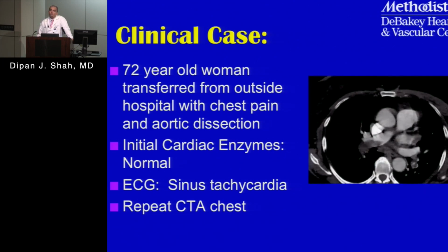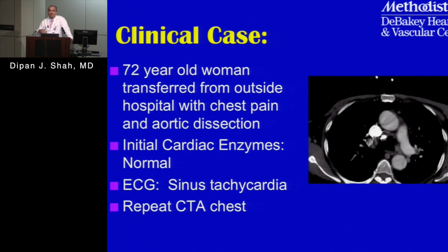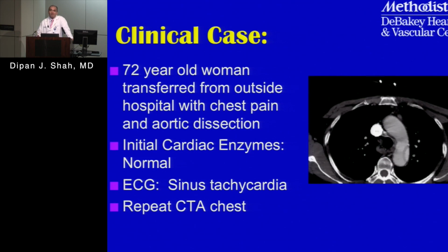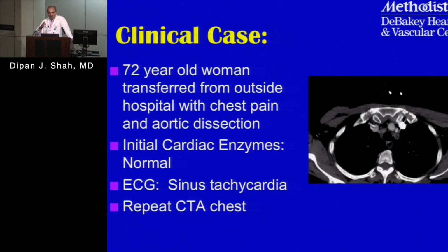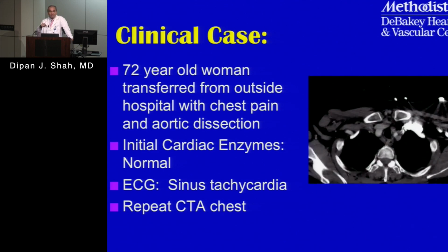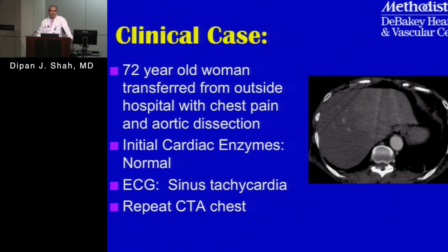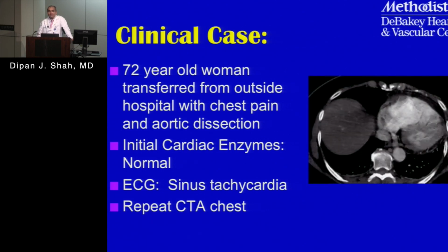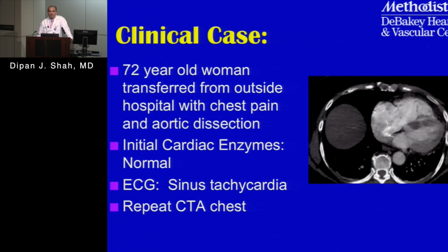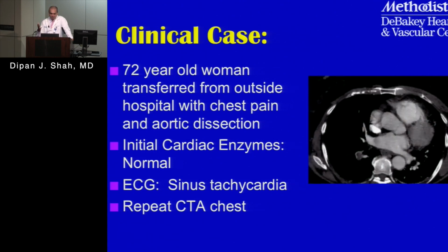Okay, so in that case, then you're saying you want another test? Okay, you want to do a gated CT? Yeah, so that would be a gated, so you're saying a retrospectively gated scan. So she's already gotten 2 CTs. You want to give her a third, because she had a CT at the outside hospital. She had a CT here. How much contrast do we give with each of these? 100 cc's, right? 120. Yeah. So that's one option. Yes, I agree.